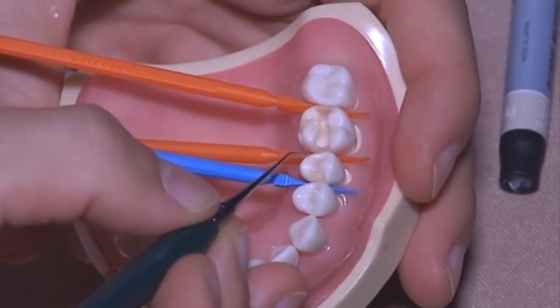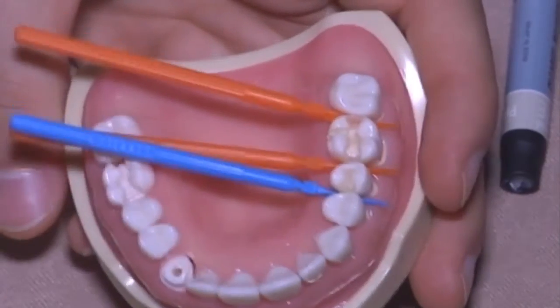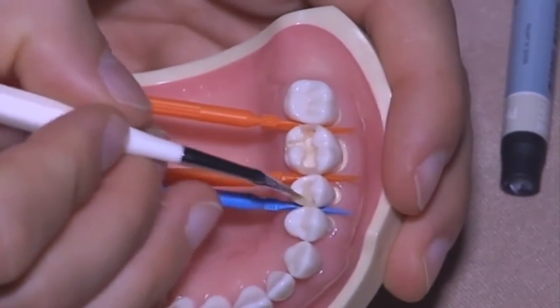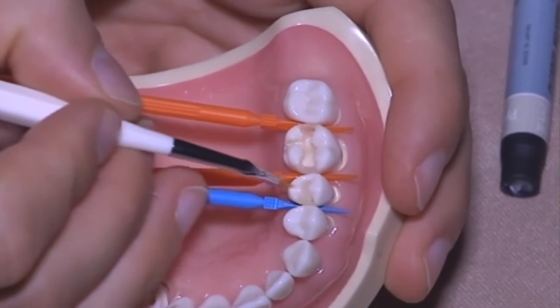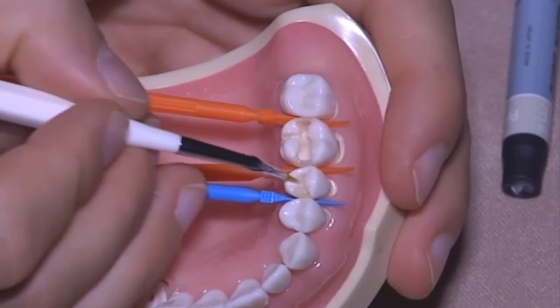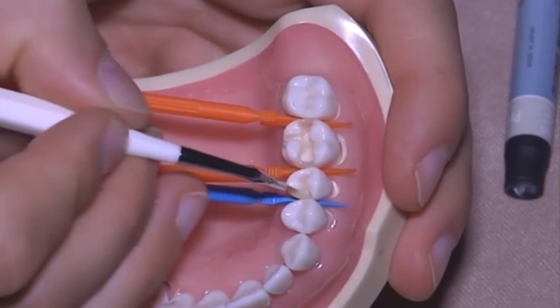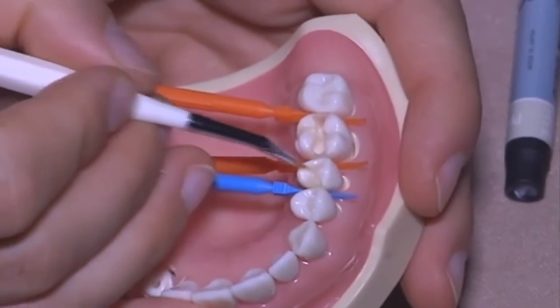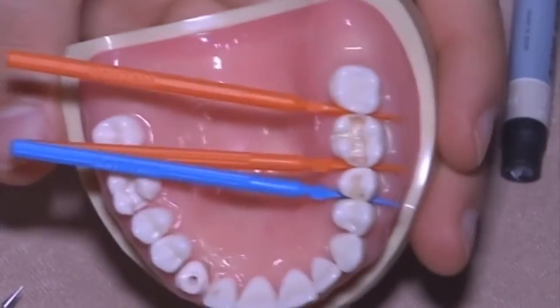Just 2 little circles there because of the premolar shape. And then I used to work also with little brushes in order to have a better adaptation on the margin, with a more gentle instrument.